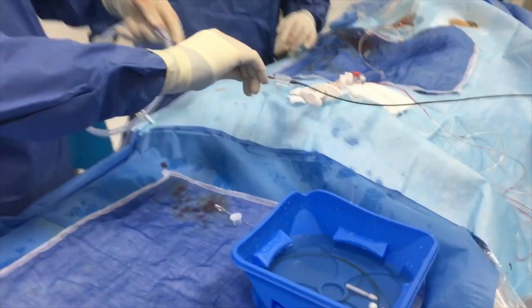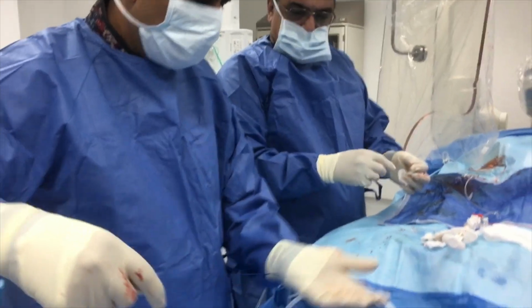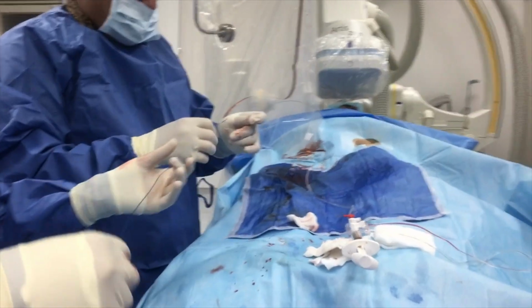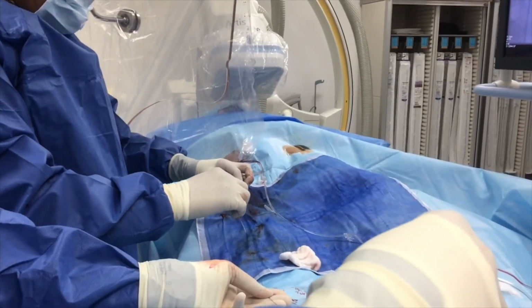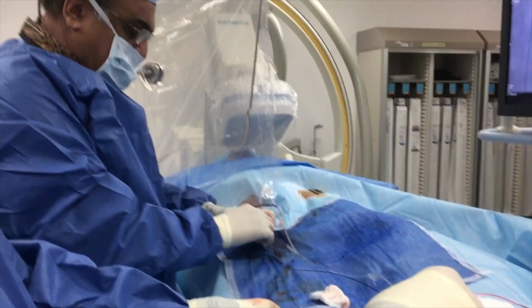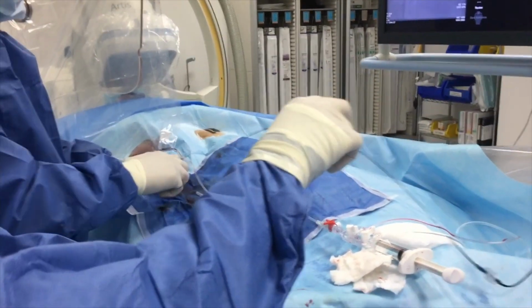Connected. Okay. Now let's show it here. So this does not need to be flushed. Okay, so no flushing required for this one. Now all we need to do is just take out this wire and we take it over the normal PCI wire, whichever we have. Flush please. Okay, now we'll show you where to take the IVUS catheter in, and then you have to do the ring down, which we will show you on the machine.